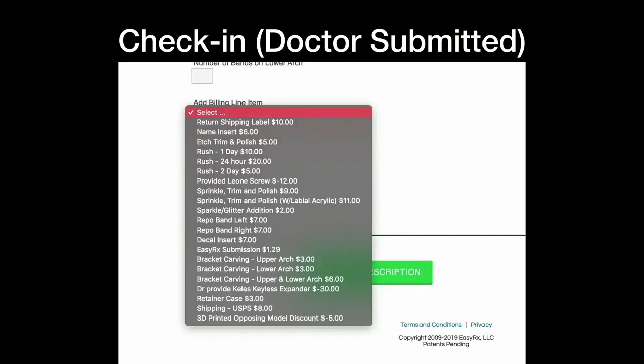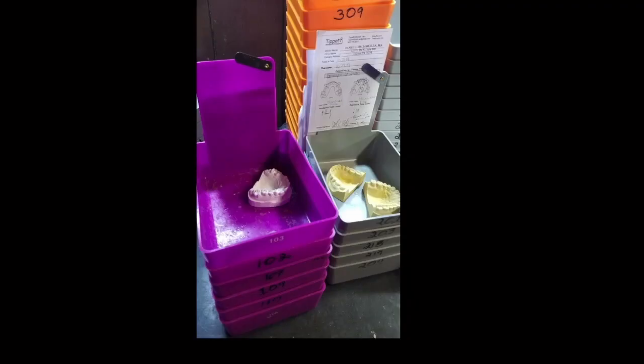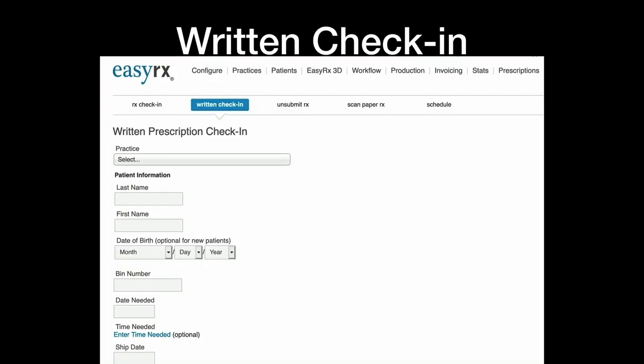Now the billing item, you come up with this. So they're trying to work with every lab in each lab's workflow. So you put your rush in there, you put your bracket carving, shipping, 3D. Anything you think of that you need an extra bill to bill the doctor for, you can put it in there. And then you check in prescription.